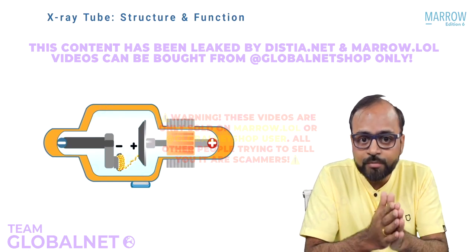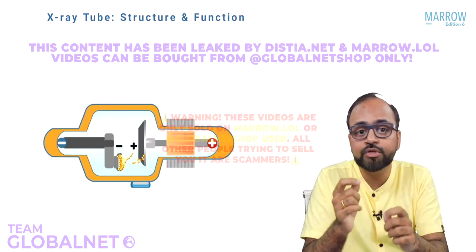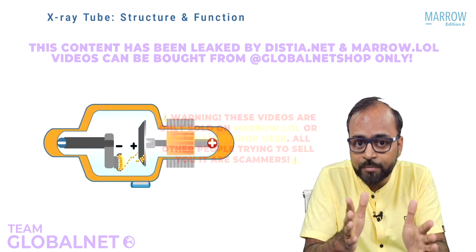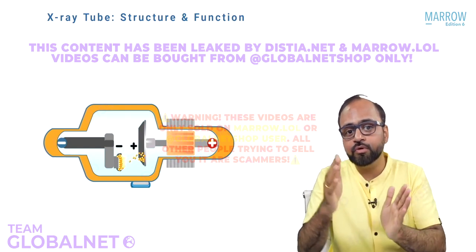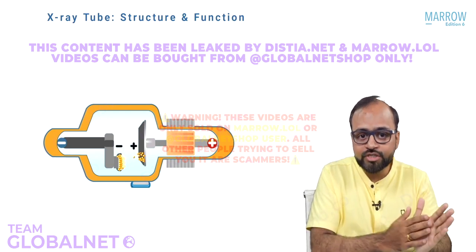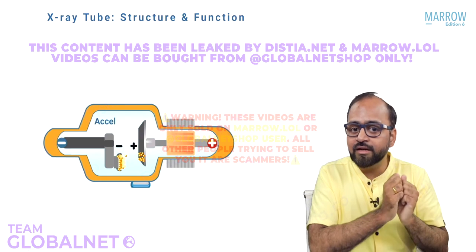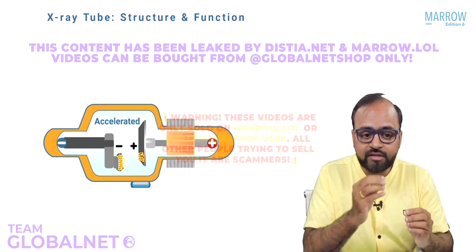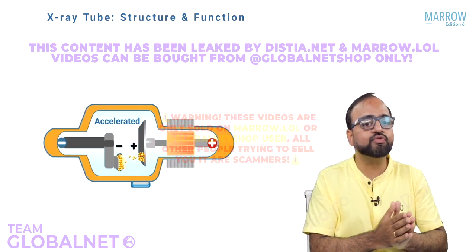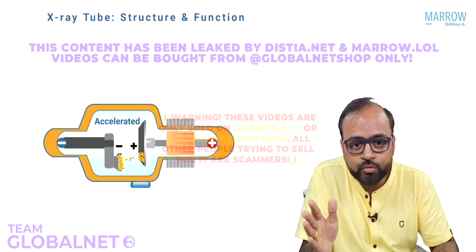But do you remember I told you that the potential difference between the cathode and the anode is very large? So what will happen? These electrons are not just attracted or pulled towards the anode, but rather they are accelerated towards the anode. Look at the animation there. Can you see that this cloud of electrons is very rapidly being pulled towards, or rather accelerated towards the anode?